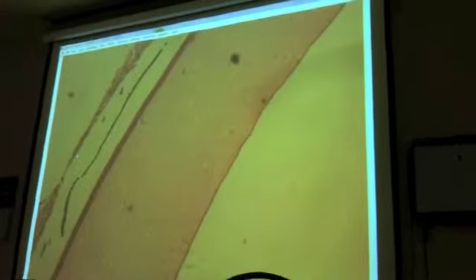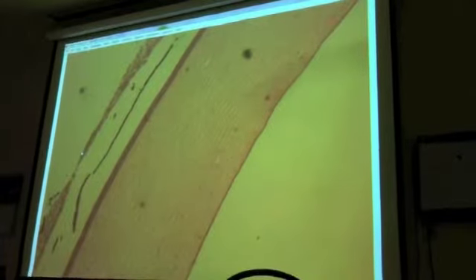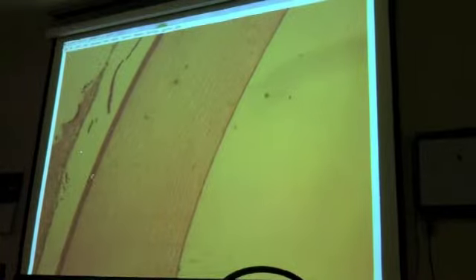So that's the cornea. Now, on this particular slide, I think in places the palpebrae or eyelids are showing. But I want to show you the cornea. It has epithelial tissue on both edges, but this front edge is called the conjunctiva.